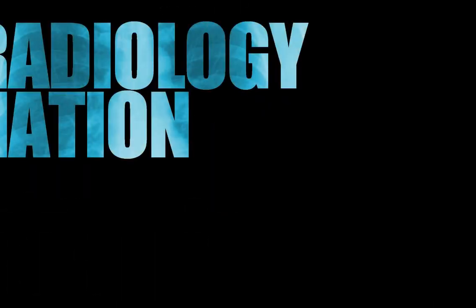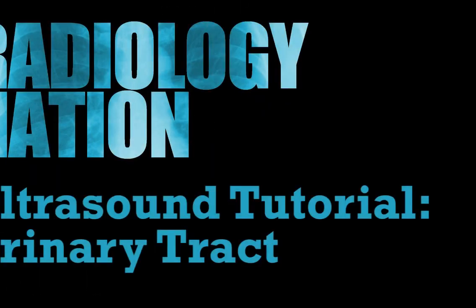Throughout this video, we have demonstrated the technique for ultrasound assessment of the urinary tract, highlighting the relevant anatomy and pathology.